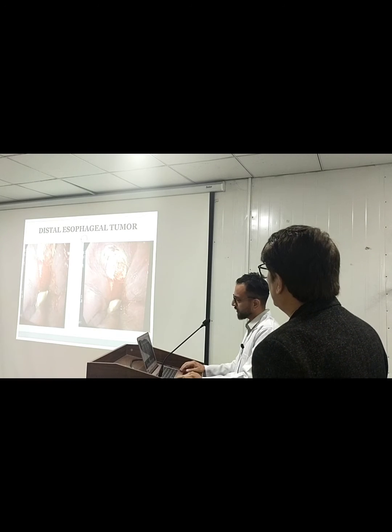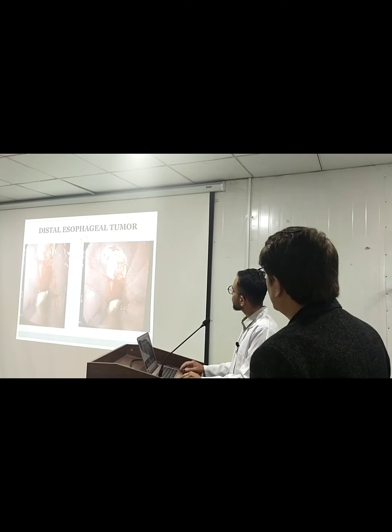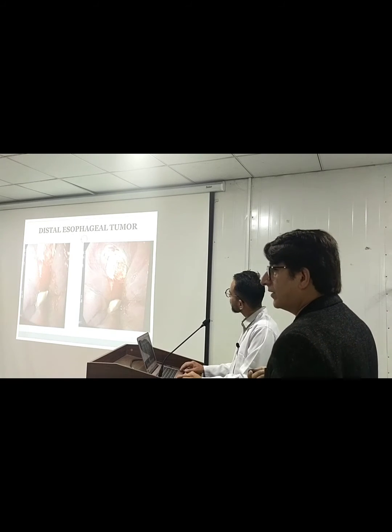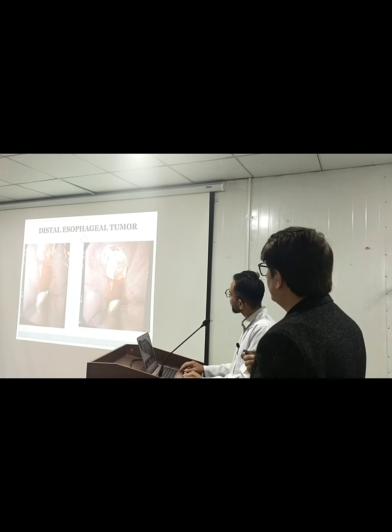Distal esophageal tumor. This is a distal esophageal tumor. Some food, you can see, is impacted because of this narrowing. Esophageal tumors are most common in our part, so we usually confront 2 or 3 patients almost in a month or sometimes in a week. So this is the distal esophageal tumor.